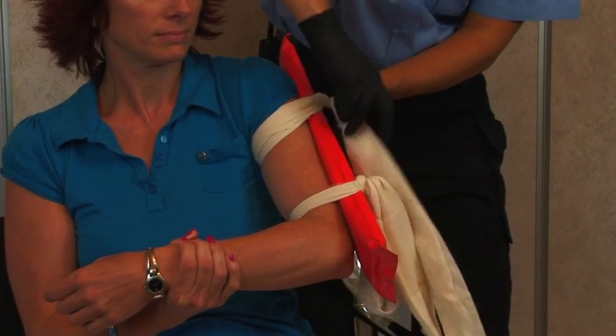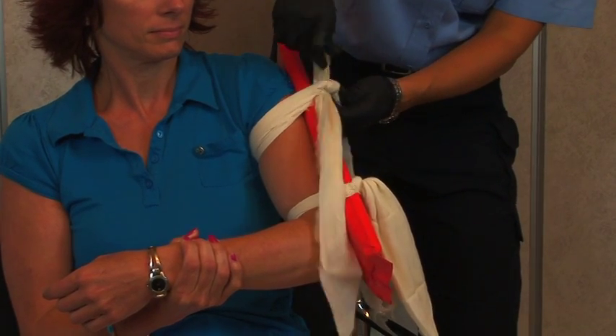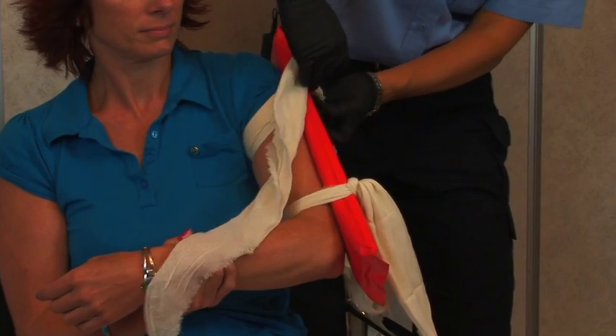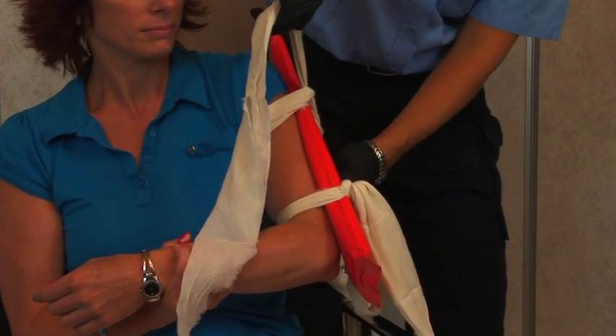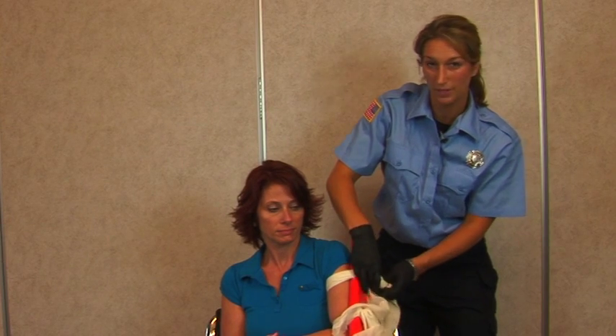Place the next one above the break and make another square knot.